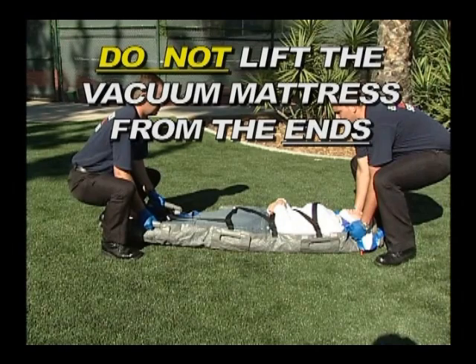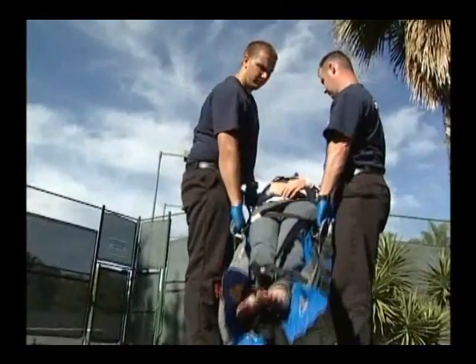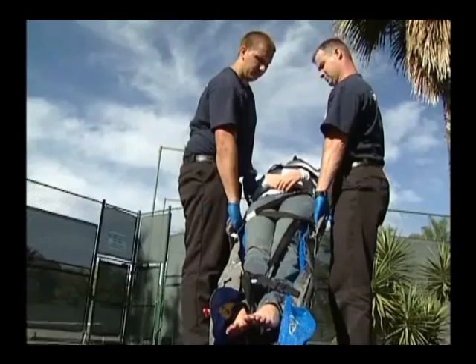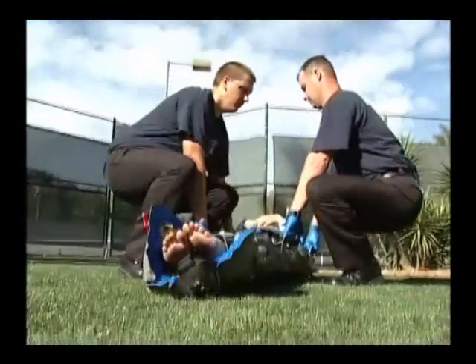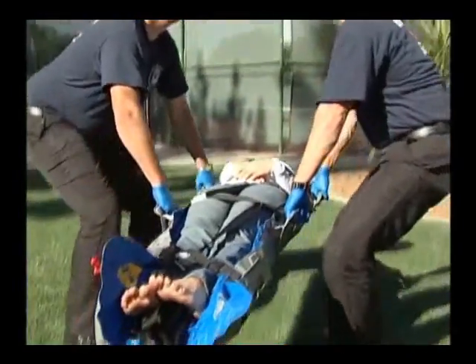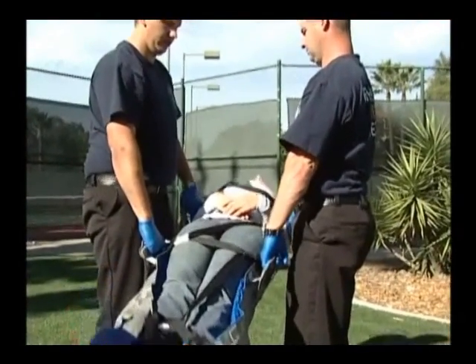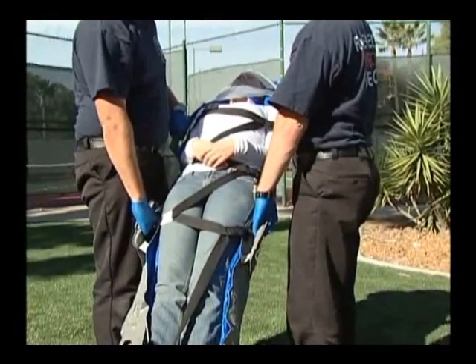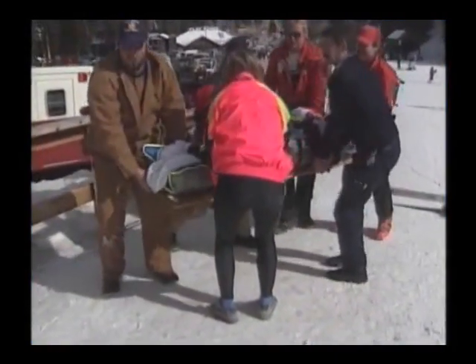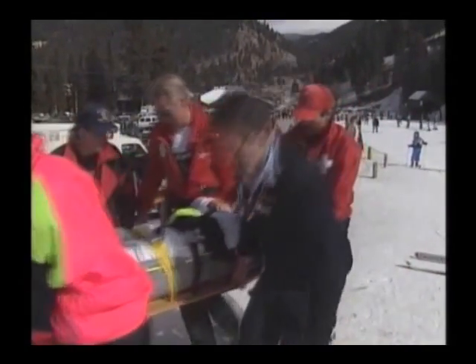Do not lift the mattress from the ends. Use the point-of-balance lifting handles only. A minimum of two persons positioned at the sides are required. Patient size and weight will determine the number of personnel required to properly lift and move your patient for transport. The large handles on each side allow for two rescuers to grasp the mattress on each side, providing four support points on both sides of the mattress for large or very tall patients. For extremely heavy patients, additional supportive devices may be needed in addition to the vacuum mattress.